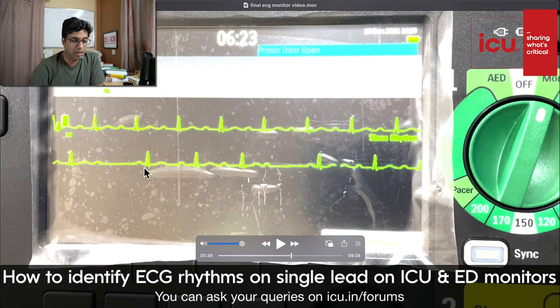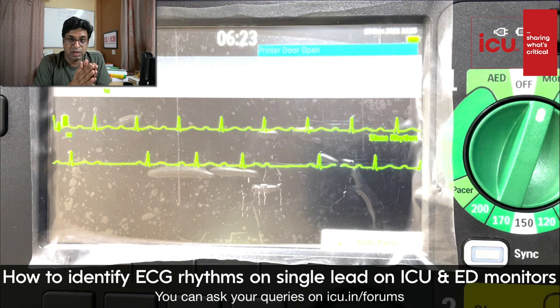Okay, so something interesting is happening. Earlier the PR interval used to be constant. Now you see there is a P wave, normal PR, QRS complex, fine. But now PR has prolonged, and PR has further prolonged, and then after a P wave a complex is dropped. P was coming regularly, but the PR interval starts getting prolonged in a regular fashion.